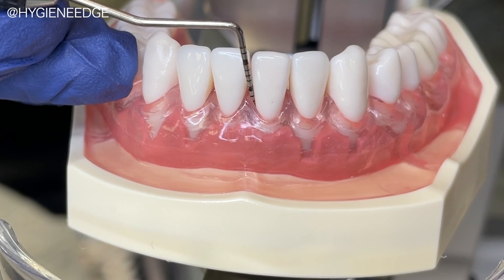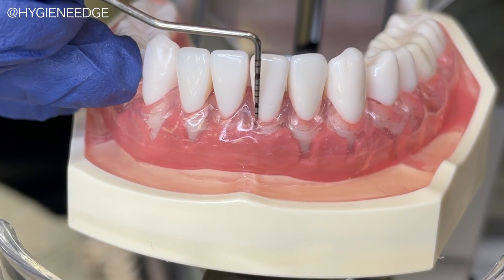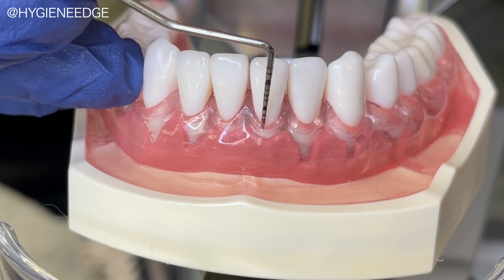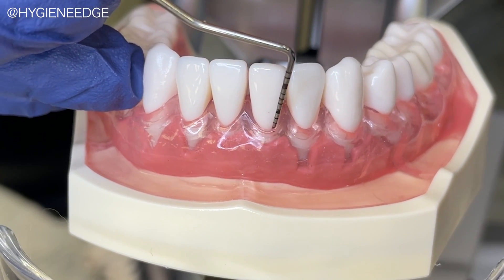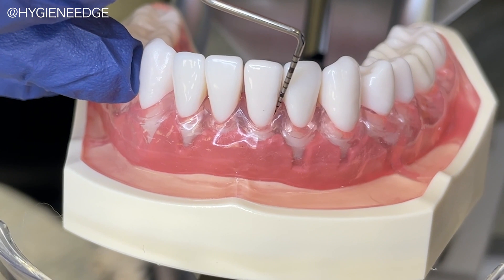One thing that is very helpful when learning to probe is having clear gums like on this Kilgore model. Just like in a live mouth, bone will dip in different spots. So this helps you to see if you're using the right pressure and tactile sensitivity to notice when the pocket goes deeper, like you can see here.